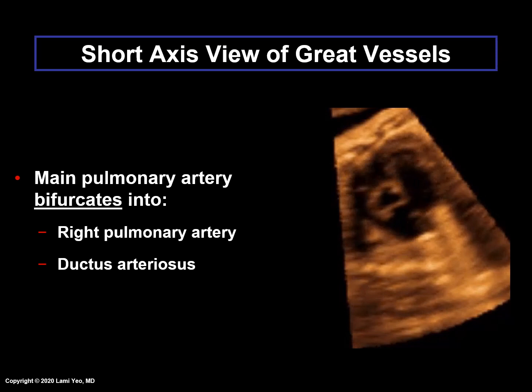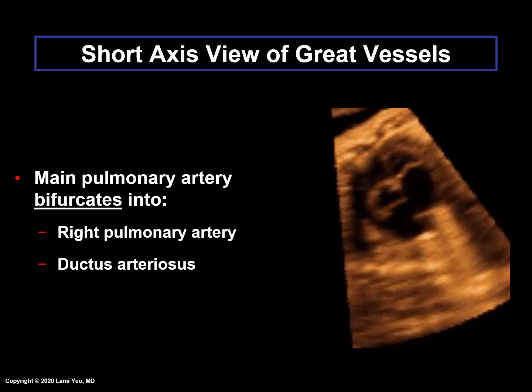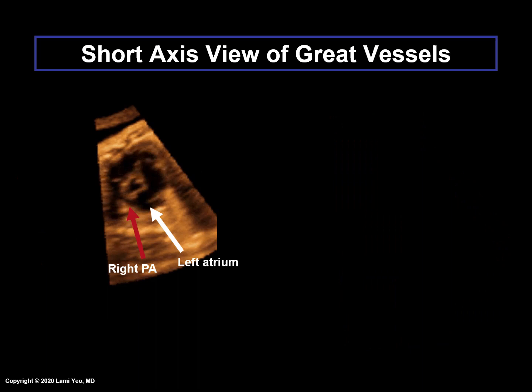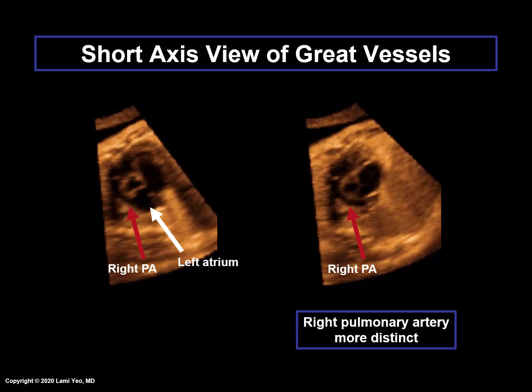In the short-axis view of the great vessels, the left atrium, right atrium, tricuspid valve, right ventricle, and main pulmonary artery can be identified. The main pulmonary artery, which bifurcates into the right pulmonary artery and ductus arteriosus, wraps around the cross section of the aorta at the level of the aortic valve. The right pulmonary artery courses under the aorta and to the right. Here is the same image with the right pulmonary artery indicated by the red arrow and the left atrium by the white arrow.